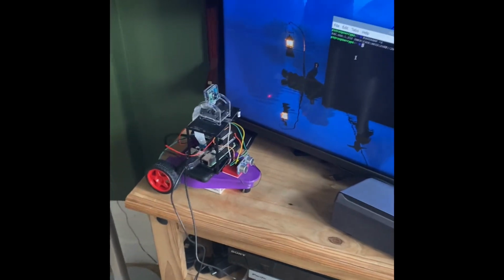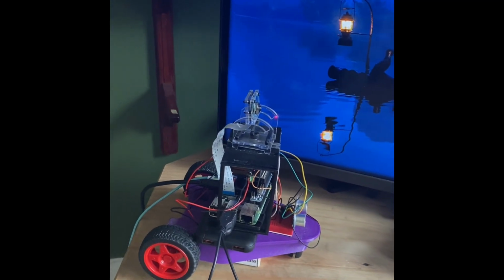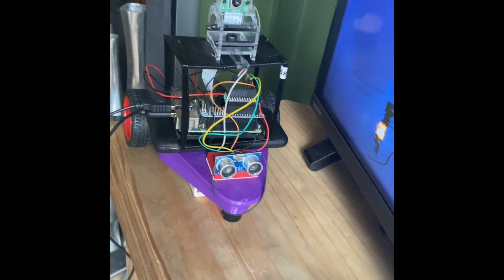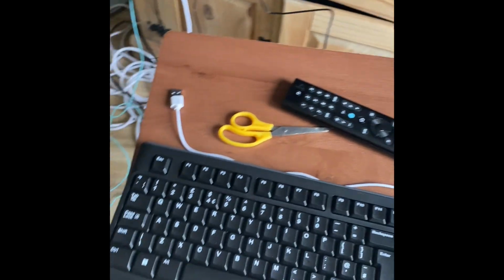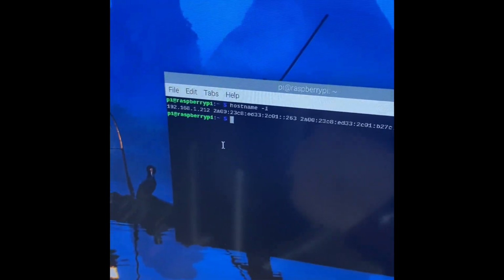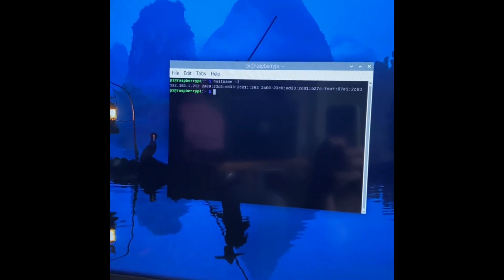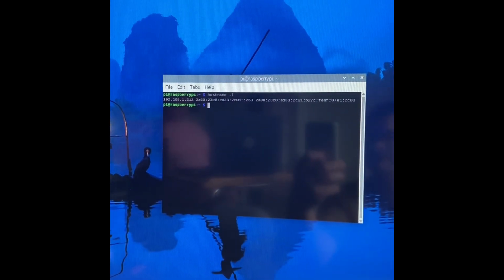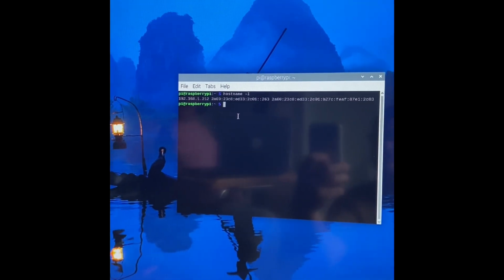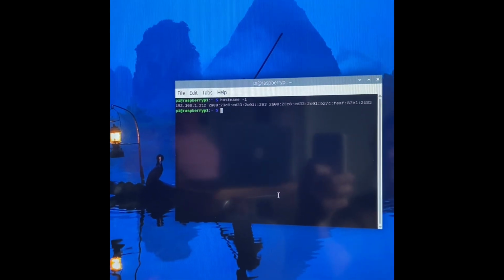This is a robot with two motors driving each of the two wheels. You will need to plug this into a monitor and plug a keyboard and mouse into the robot. Then open a command prompt and follow the following instructions. So first you need to open up the terminal on the Raspberry Pi and type in hostname -I. That will give you the Raspberry Pi's IP address and allow you to connect your Raspberry Pi to your computer.